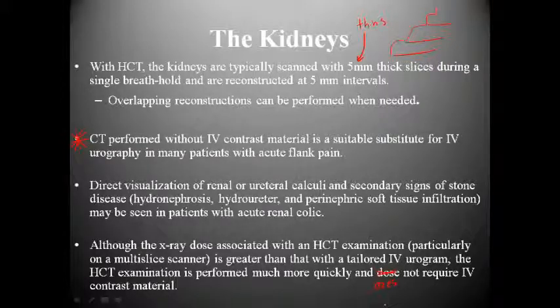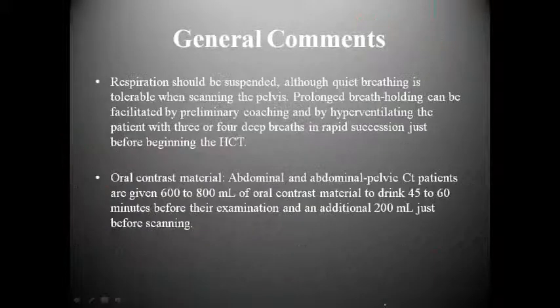And so because of that, you saw something else when you were looking solely for the kidneys. And so being able to see other causation factors, that's what makes CT so great, just because it aids in diagnosis so vastly.